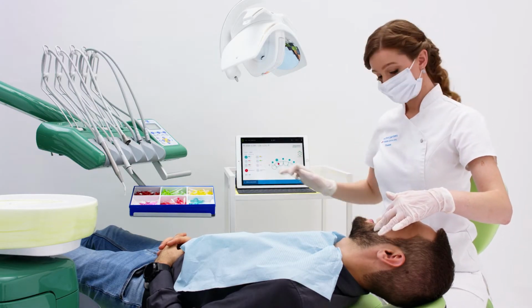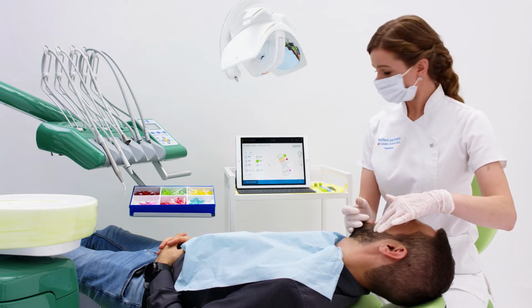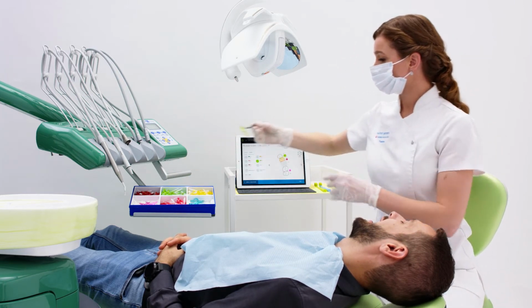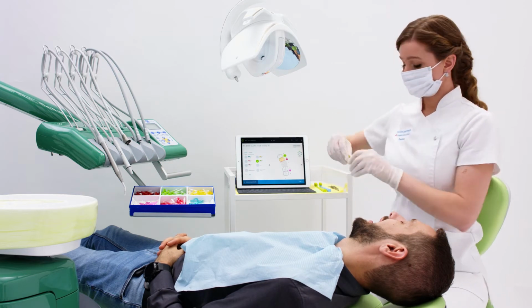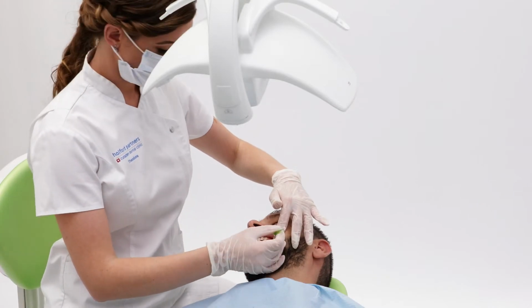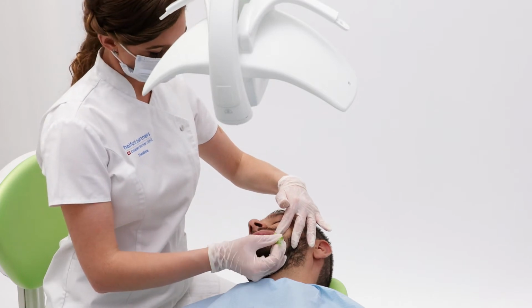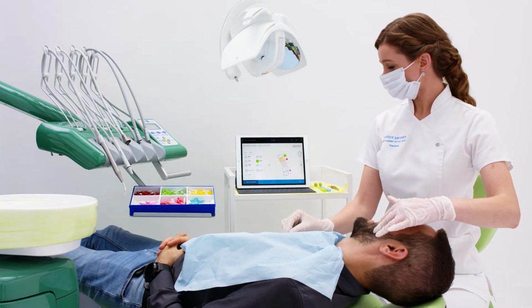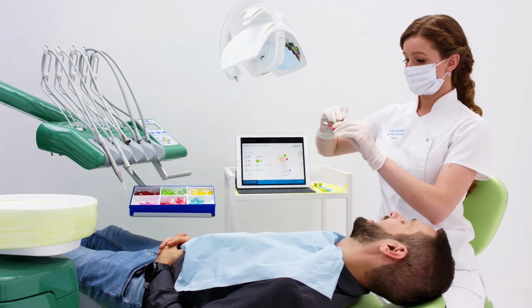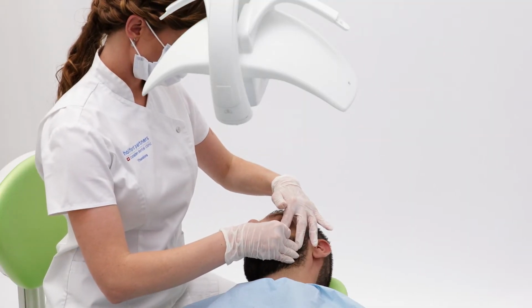I also input where there is bleeding present. Moving on to the upper left sextant, I check and measure inflammation with the Prime Green Red Perio 405 brush and Prime Pink brush.